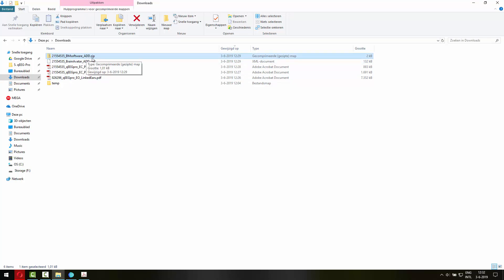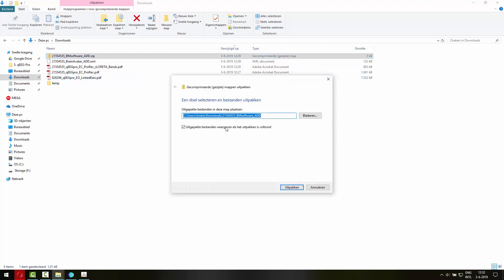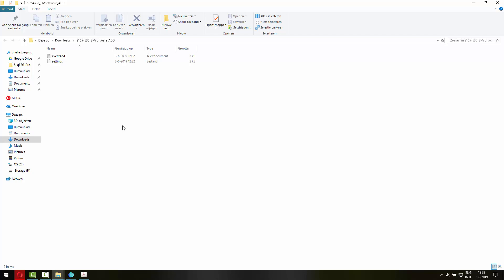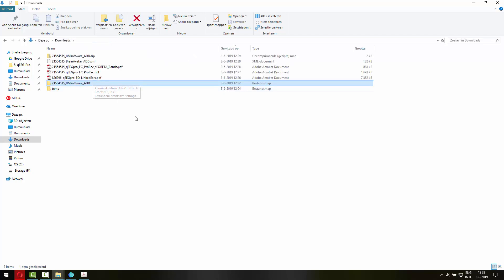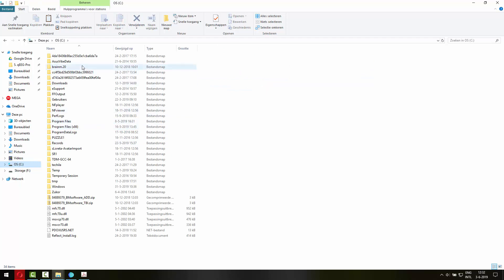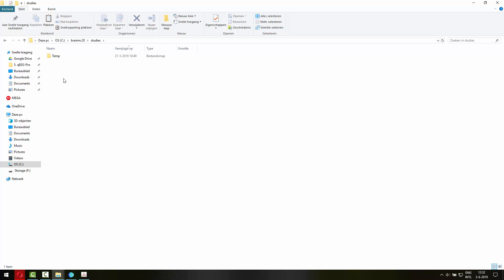You get a .zip file and you need to extract that. So right mouse click, extract that to a folder. You can use the same name and then copy that folder to the Brain Master software's folder and then the studies. So let me copy that right here.